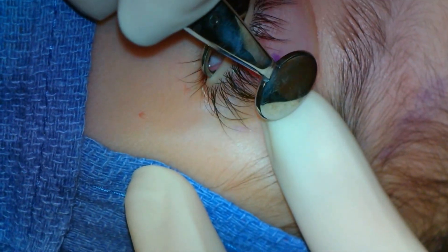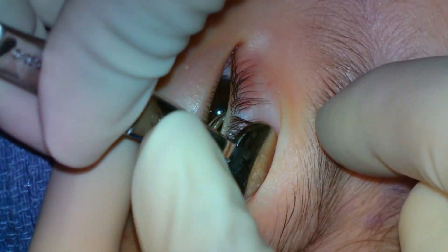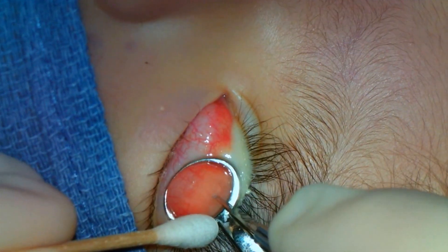The fifth lesion is on the upper eyelid. The clamp is placed and the eyelid is everted. The incision is made and the contents are expressed.